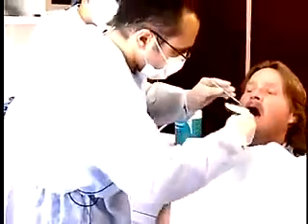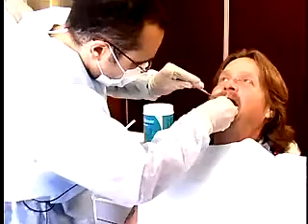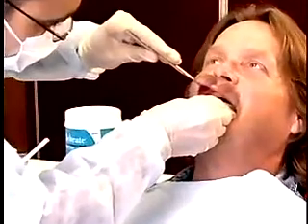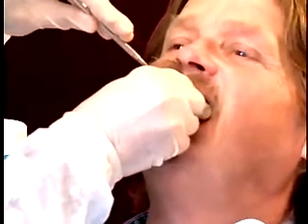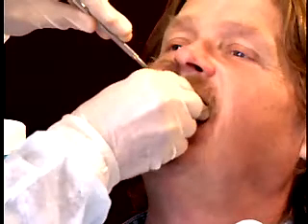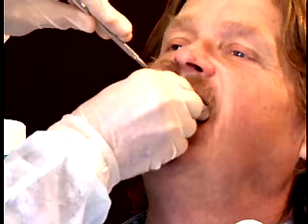Stand in front of the patient and place the tray at the left corner of the mouth. Reflect the right corner of the mouth with a mouth mirror. Seat the loaded tray posteriorly first, then push slowly to the front so that the alginate flows anteriorly. Center the tray over the residual ridge so that the tray handle is in alignment with the median line of the face.